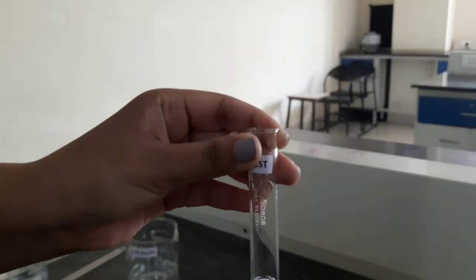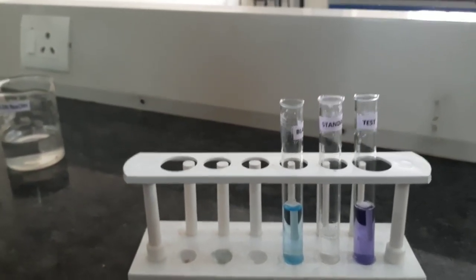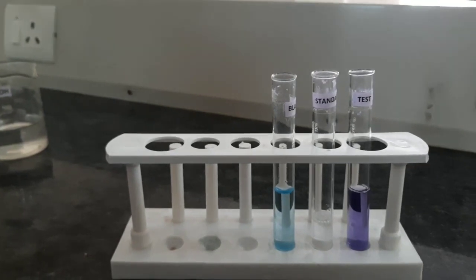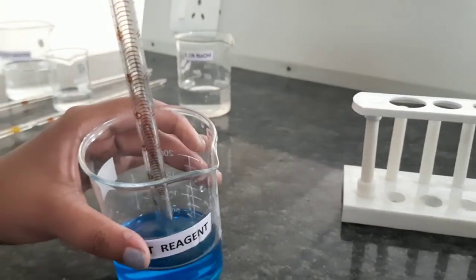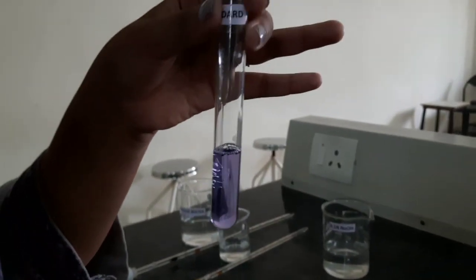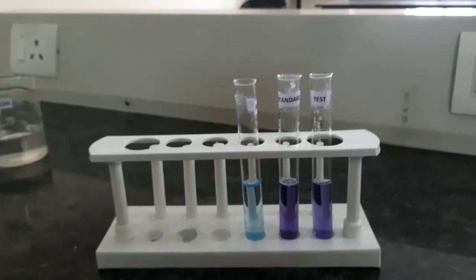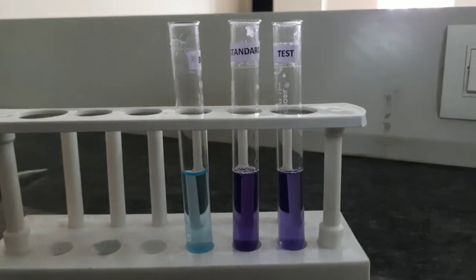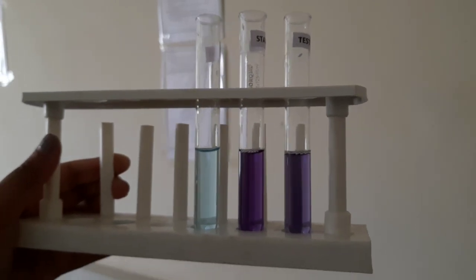Now you should also add biuret reagent to the standard tube. Now we are adding biuret reagent to the standard tube as well. You can see the protein present is already reacting with the biuret reagent to give a purple colored complex even before the incubation. Please note the color. Even before incubation, it has turned purple because of excess protein.